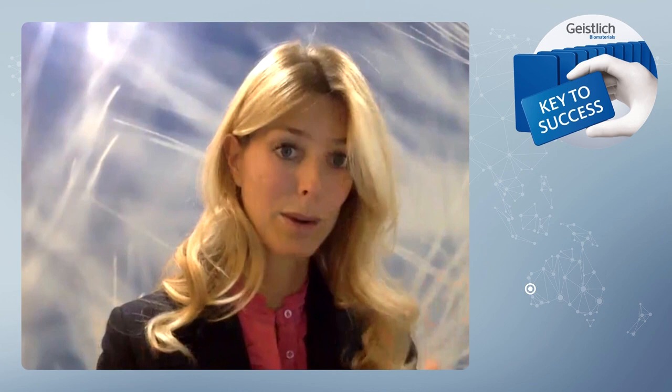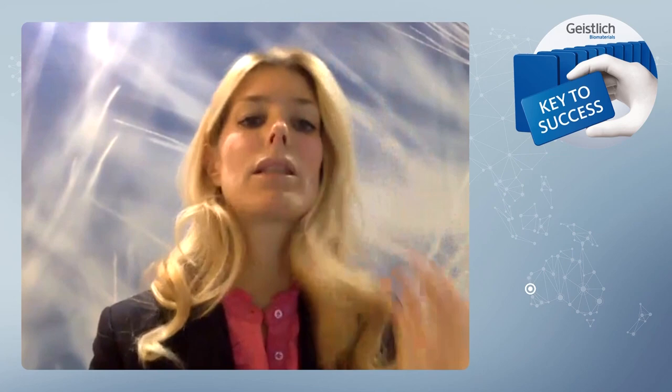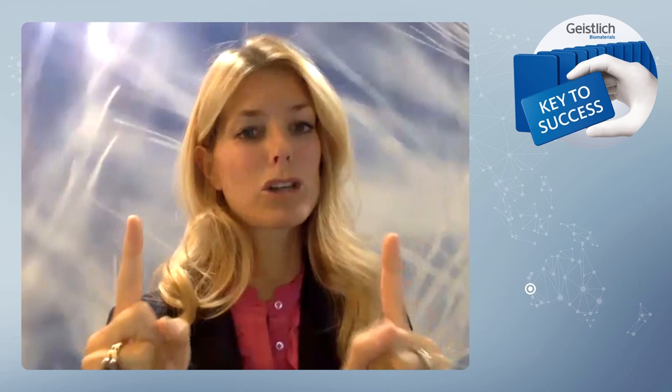What happens to the vertical screws that are placed during the grafting? Okay, so the vertical screws are the tenting screws. The purpose of them is only to keep the particles. When you have a large defect in a mesiodistal direction, usually around 2 to 3 edentulous spaces, they are used, one or two, in an oblique way to basically hold the graft, the xenograft particles, in place.